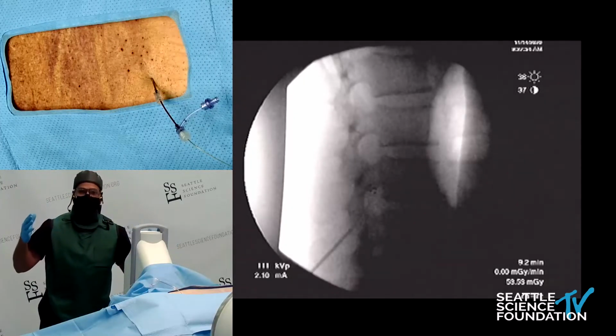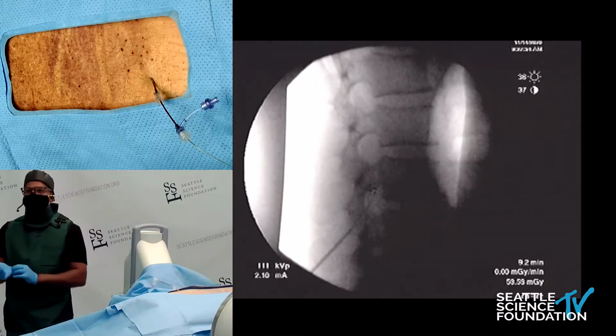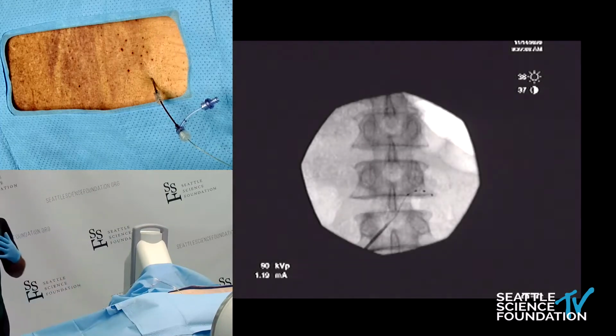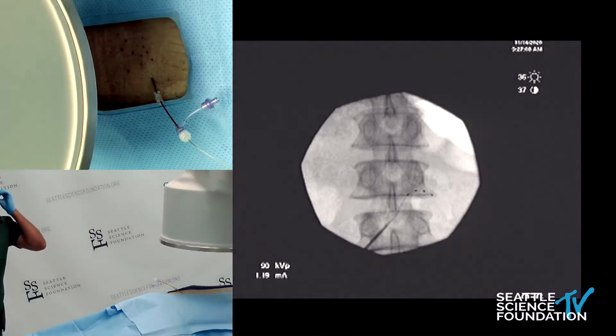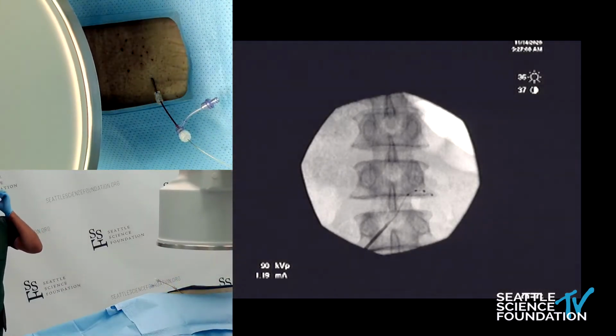I'm really happy. So Justin will come back around to an AP. And now, really, the procedure begins, because you might be thinking, well, gee, I just got my lead out over the DRG, like I'm super happy, I'm done.